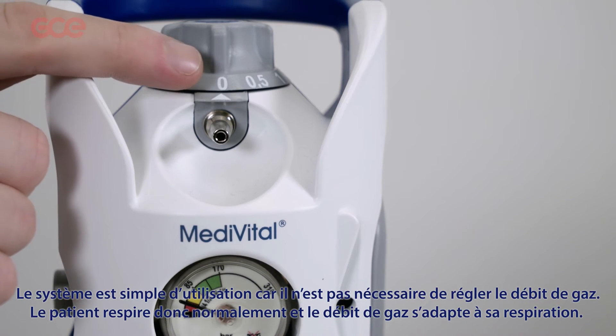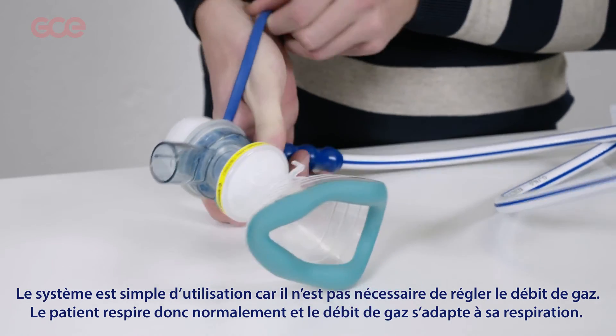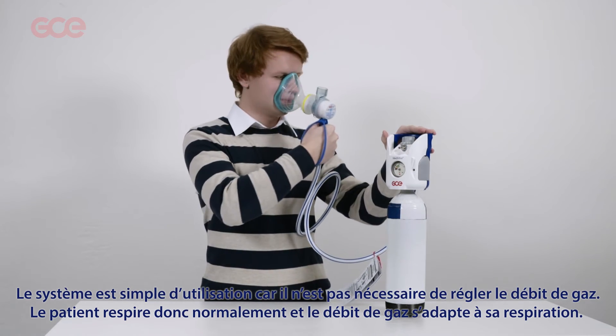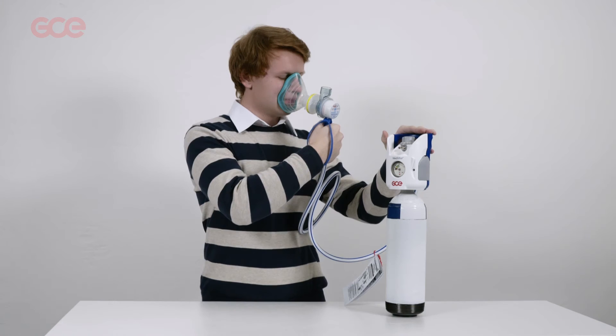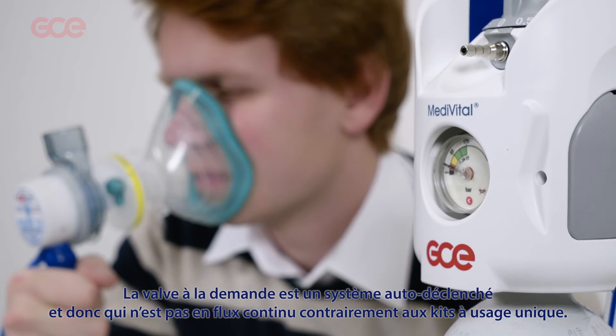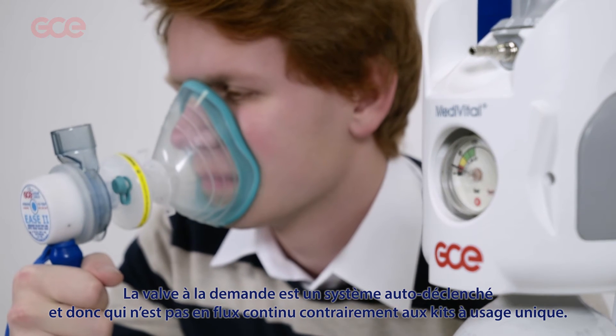It is a very user-friendly system. It is not necessary to set the flow of gas. The patient breathes normally and the gas flow adapts. The demand valve is an automatic system, not a continuous one like the disposable kits.